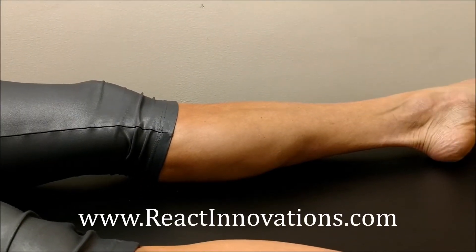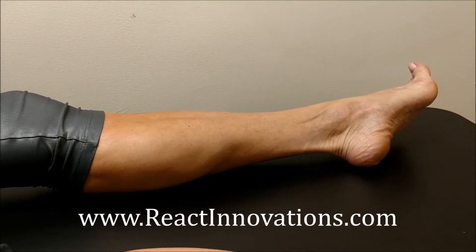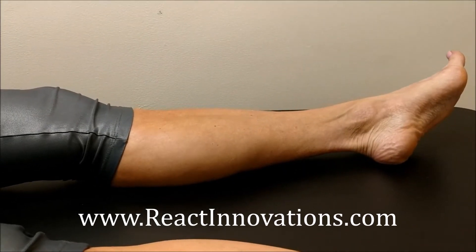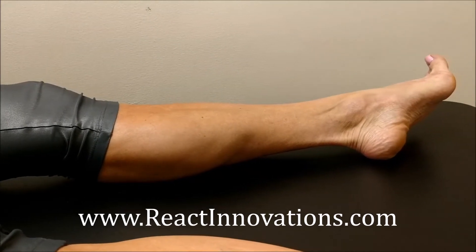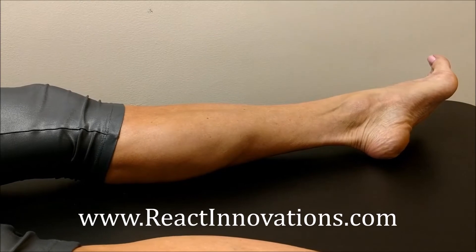What we can see here is that we're manipulating the calf entirely up and down the leg, holding that calf in contraction. No wires, no e-stim pads, no needles, no lasers — bringing a tremendous amount of blood flow to that part of the region.